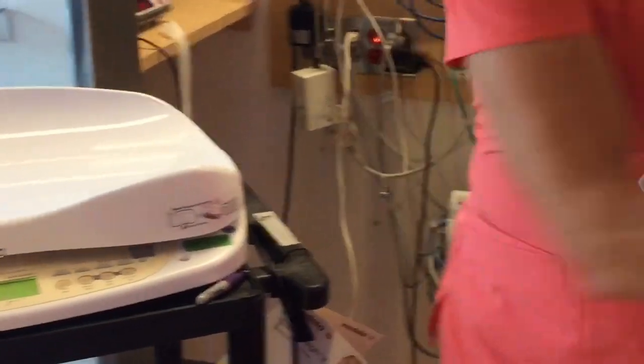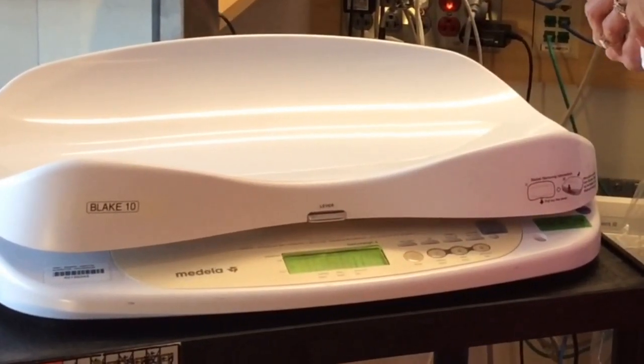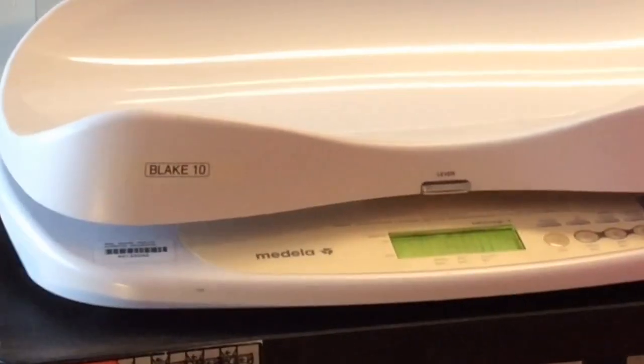You're going to hook the baby back up to the monitor and feed the baby. If the scale has powered off, press the on button and wait until zero appears in the display. The pre-weight is saved in memory even if the scale is powered off.